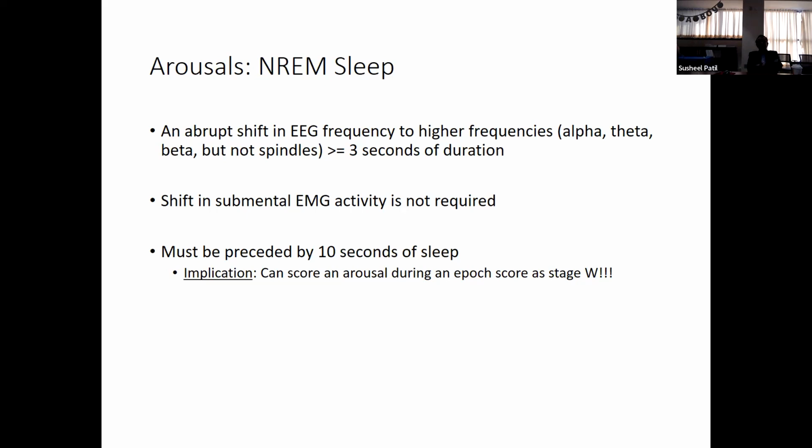They can be subtle. And then the other point is that an arousal must be preceded by at least 10 seconds of sleep, as defined by how we've looked at it previously. So what's the implication of that last statement? It's an important one, which is that even though an epoch is scored as stage wake, you can score an arousal during a wake epoch.